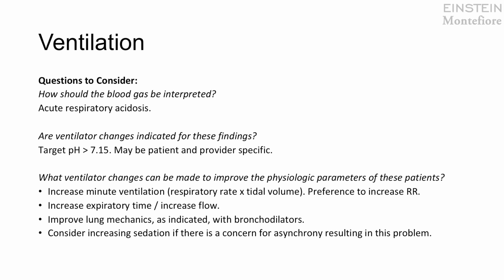The only thing to be mindful of is the fact that oftentimes in patients with obstructive lung physiology, you can get air trapping and decreased venous return, which can cause hypotension and hemodynamic instability. For ventilatory failure as well, at times increasing sedation can increase synchrony and lung mechanics. And so this can be an option as well. Another option in addition would be if a patient is obstructed, if they're wheezing and they have true airways exacerbation, you can administer bronchodilators and steroids.